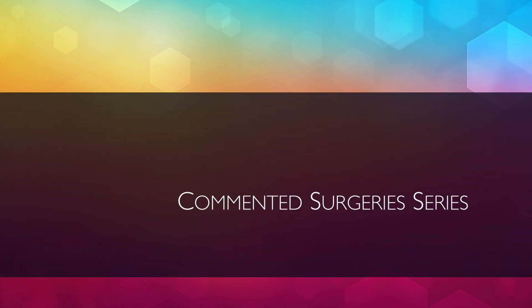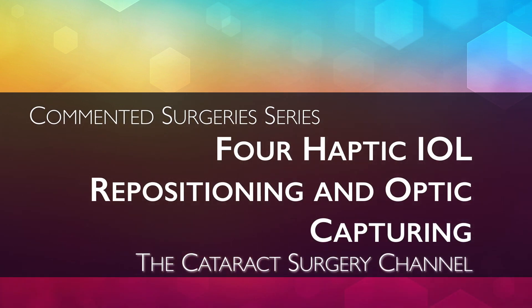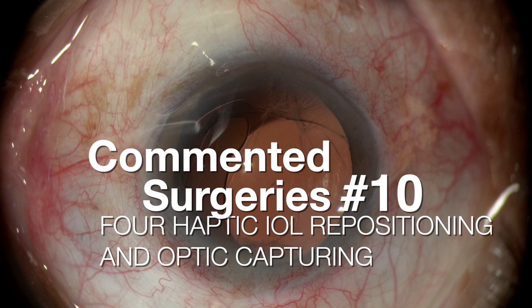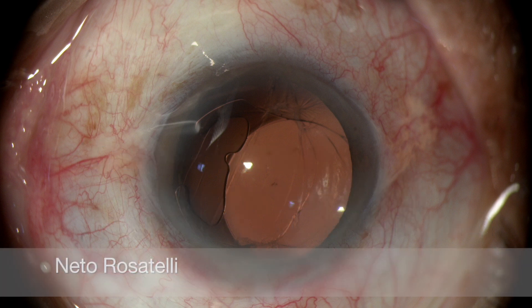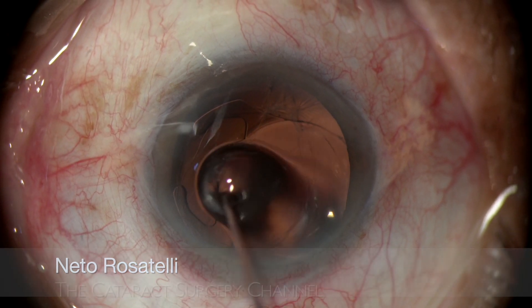Hello, my name is Neto Rosatelli and welcome to the Cataract Surgery channel. This commented surgery is on a case of severe IOL dislocation where IOL repositioning and optic capture is done with minimal manipulation, ensuring a very good result.